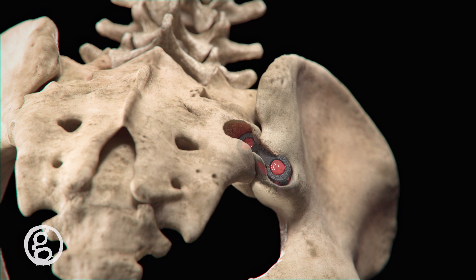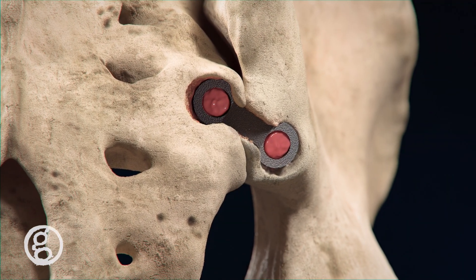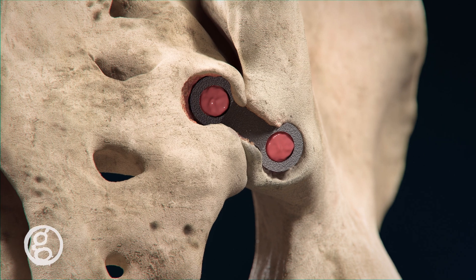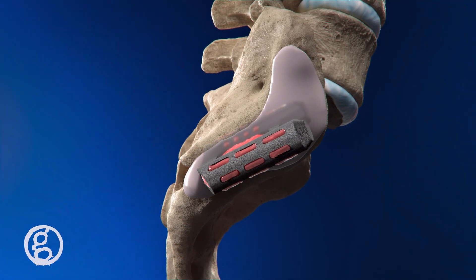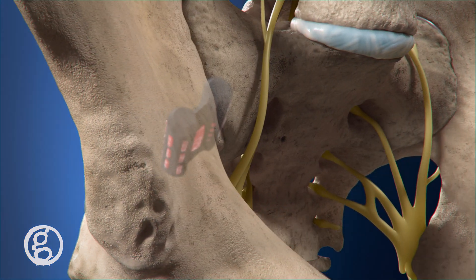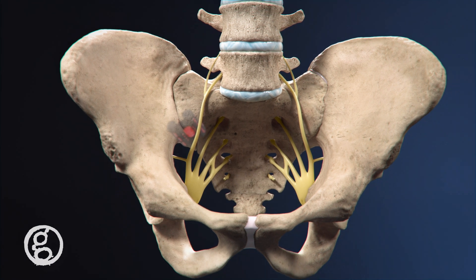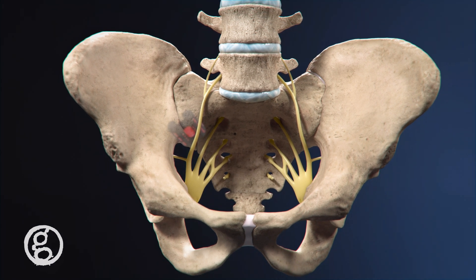Transfixing the SI joint, the Catamaran is placed directly into dense cortical bone, avoiding the dorsal gap. Following the natural pathway of the SI joint, the Catamaran's trajectory is directed away from critical neural structures. Using an inferior posterior approach, the Catamaran SI joint fusion system offers a new option for patients suffering from SI joint dysfunction.